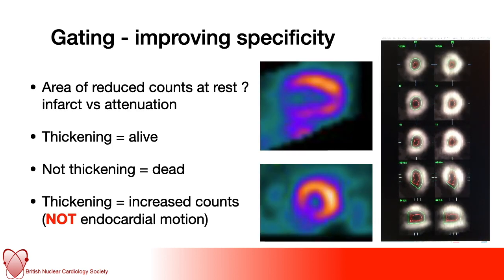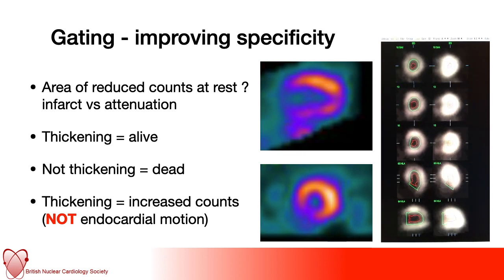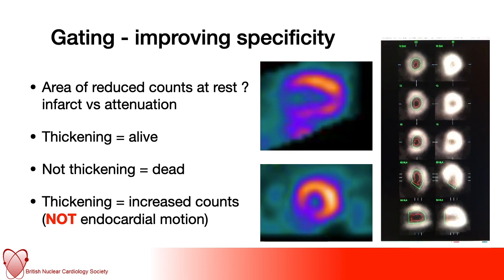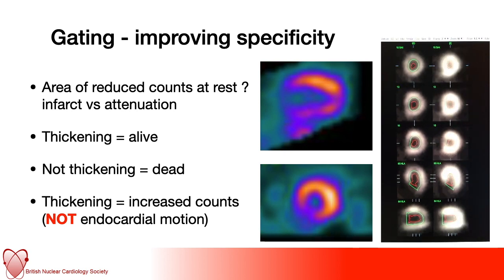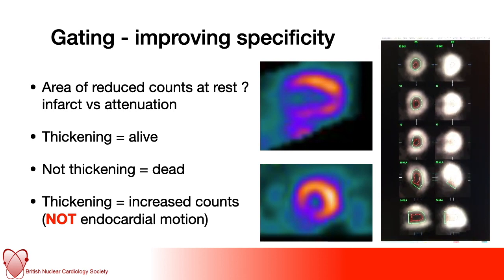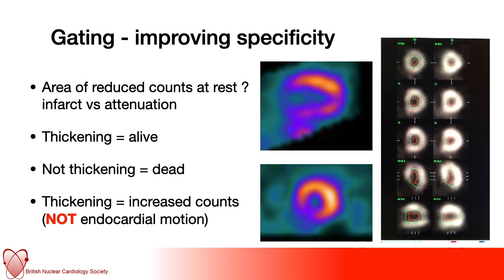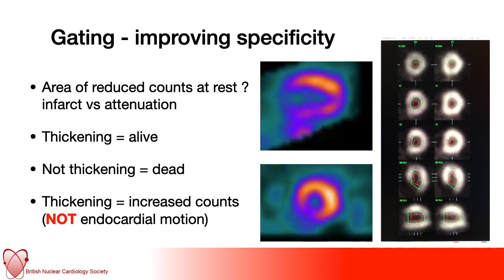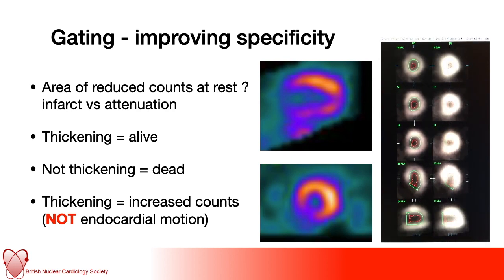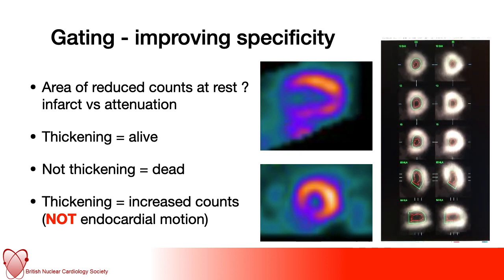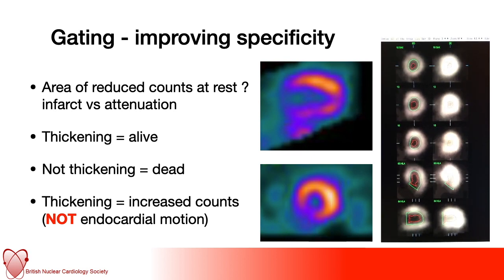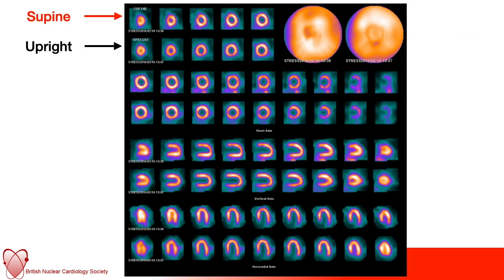This is what we're talking about with gating — giving us an idea of regional wall thickening. This is not endocardial motion as seen on echo; it really reflects increased counts in systole. In the middle slide you can see reduced counts in the inferior wall on the vertical long axis and short axis images, but on the right-hand side that wall is clearly moving very nicely. If you only saw those perfusion images you might wonder whether this was an infarct, but the normal wall motion makes clear it is not dead — this likely reflects subdiaphragmatic attenuation, perhaps a large abdomen, rather than true disease.